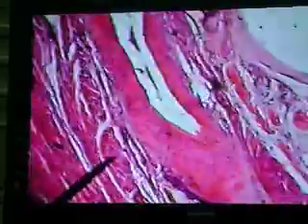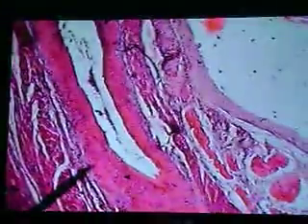Now when we look in the heart, there are a number of things that we may see. Let's just look around and see what else we can see. Sometimes we can see the coronary arteries. So, Larry, this is a large blood vessel right here. This could be considered also technically, because the heart is really a blood vessel, a large one modified for pumping.